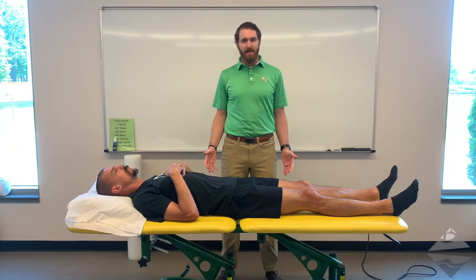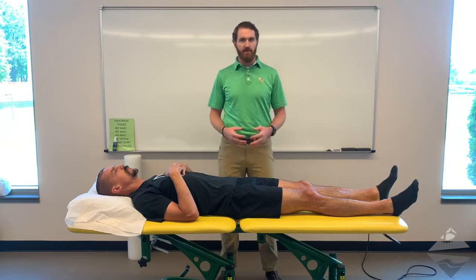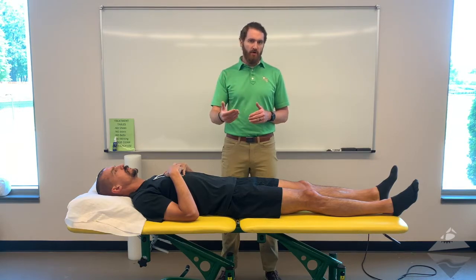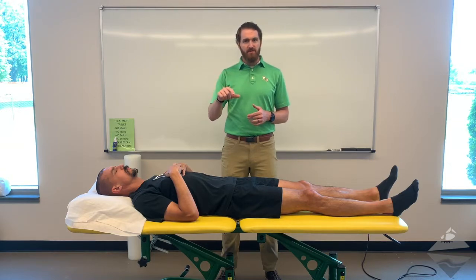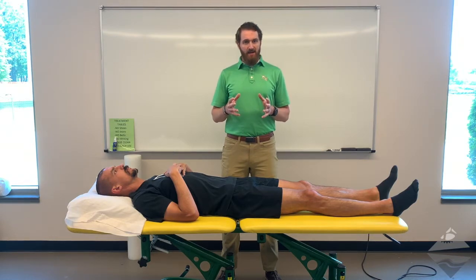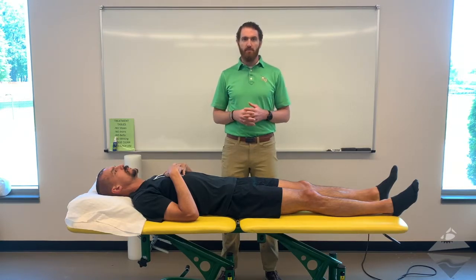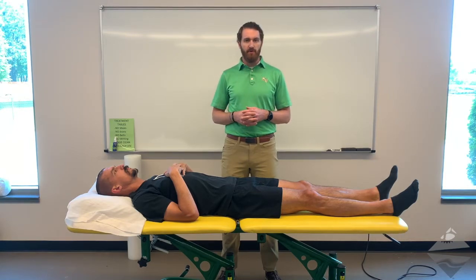Today we're going to be talking about hip range of motion assessment, specifically looking at passive range of motion assessment with goniometric measurement. Prior to doing this, you would hopefully have already completed a lower extremity screen — I'll link that video so you can review it. That portion is typically done in a seated or standing position, so once completed you're ready to perform the passive range of motion assessment with or without goniometric measurement.